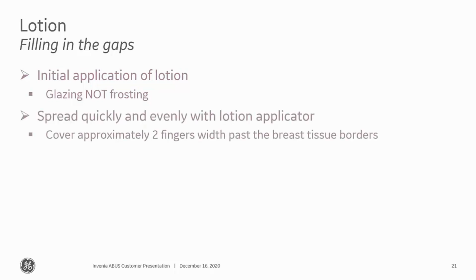All right, so filling in the gaps with the lotion. Initial lotion application. We want to emphasize we're glazing, not frosting. For the users that have been around a while, you know that we used to put a lot of lotion on, and we are backing off that. We've learned over time that it's not necessary to use that much lotion, and we also know that it helps our cleanup process go a lot quicker. So glaze, don't frost.